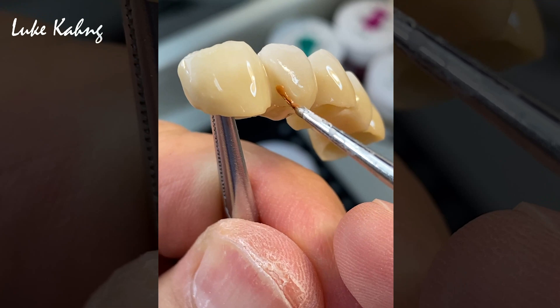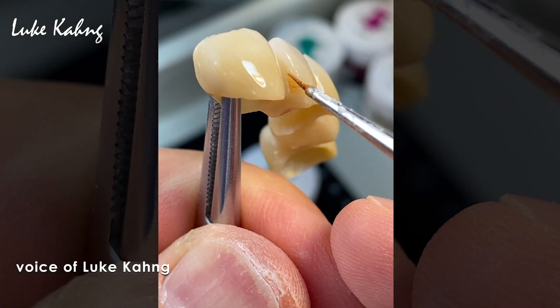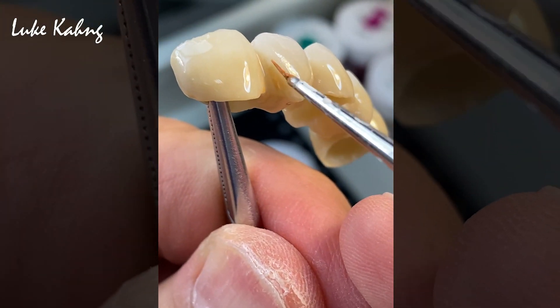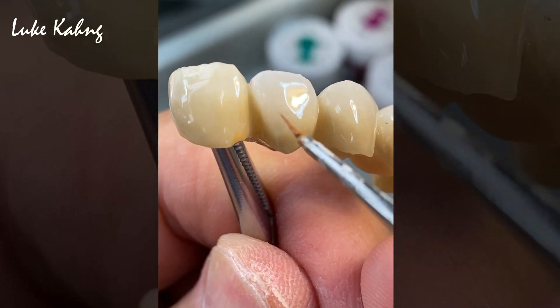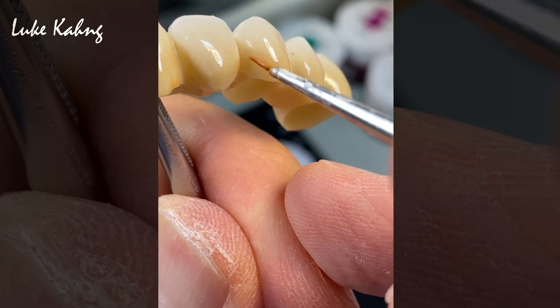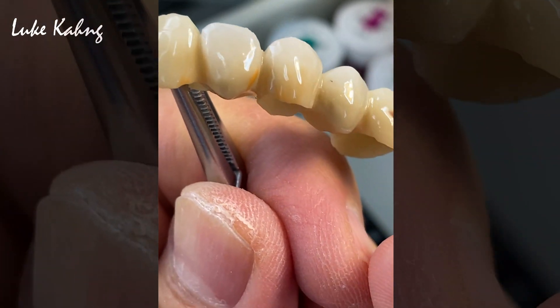So this is the finals. This is very subtle — the warmth in between the tooth, especially C4 color, is maximized. Just like this.